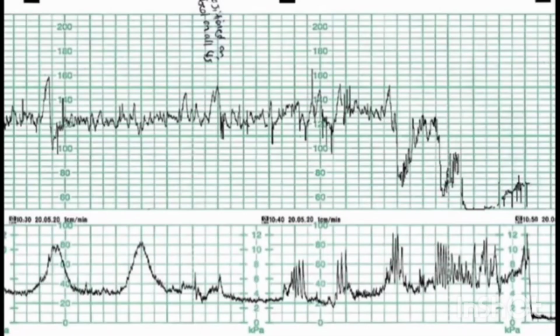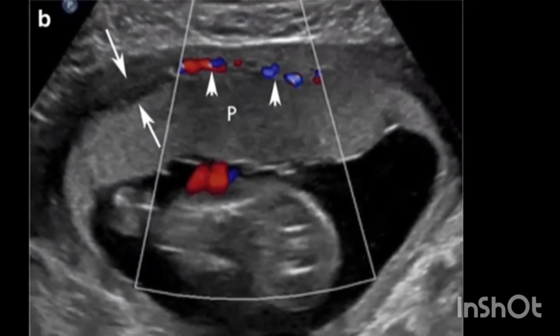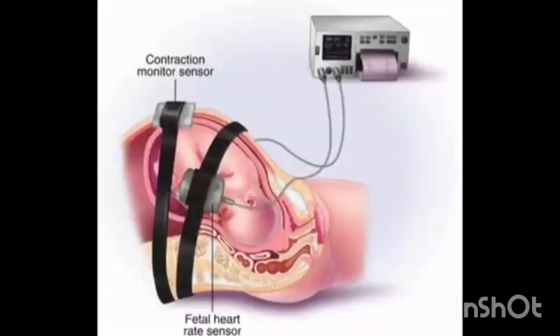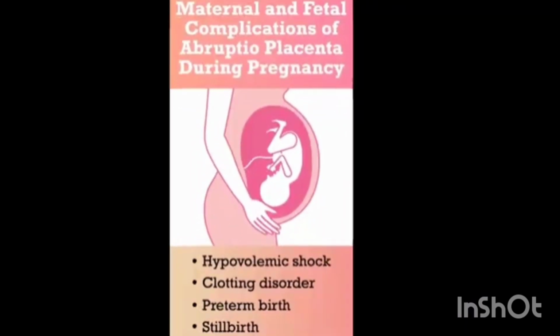The presence of associated concurrent fetal bradycardia carries a poorer prognosis. Management for small abruptions is usually conservative. Serial sonographic examinations, with measurement of the retroplacental clot volume, antepartum heart rate, and maternal symptoms has been suggested.